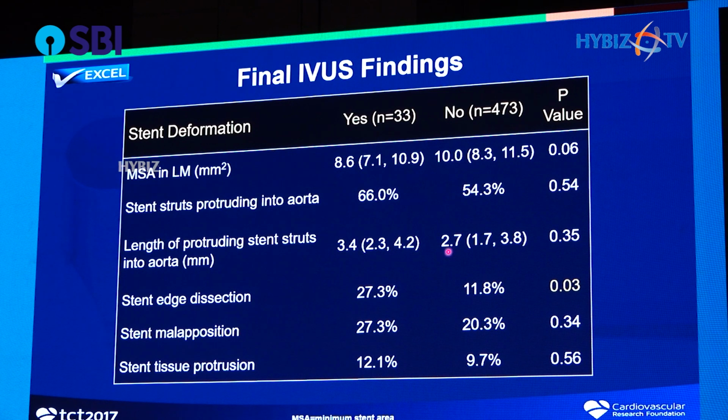At the end of a very complex left main stenting, you really have to disengage the guide and check the IVUS up to the end of the stent, making sure there is no deformation. And if there is, we just have to open again to optimize. That procedure is quite necessary.